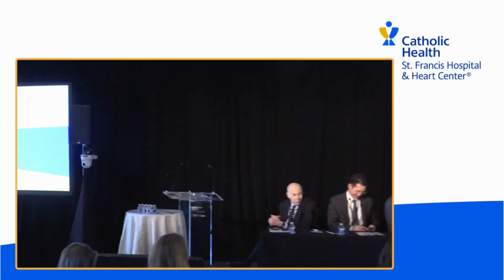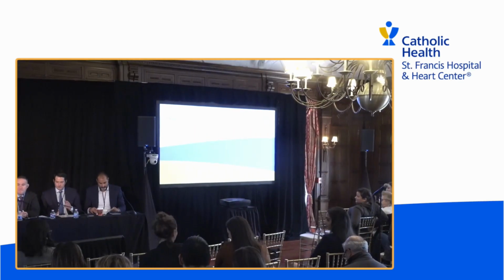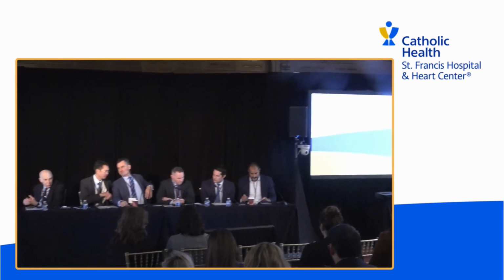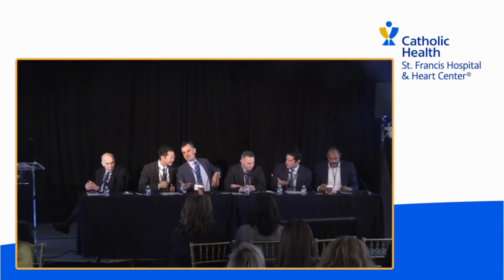Does anybody have any questions? I will say maybe one thing. For this patient above 90 years old, a lot of time we use a dry seal. It was proposed on the initial slide, tortuous vessel. We like to put an 18 French or a 22 for the 34 with Evolut because it makes everything easier, neater, especially if you have to do a BAV like that. Yep, we do that sometimes too, depending on the situation, the tortuosity, and if we expect there's going to be sheath changes.